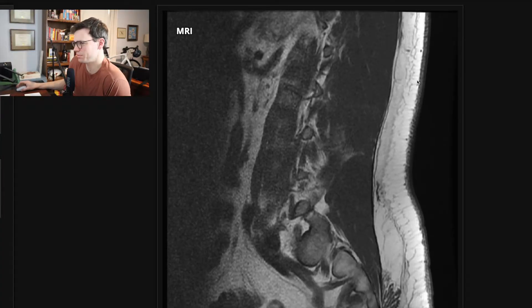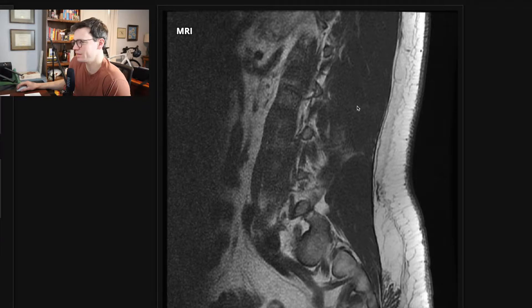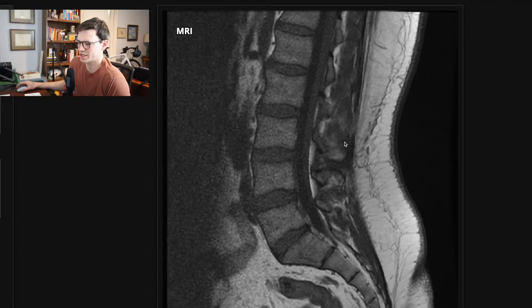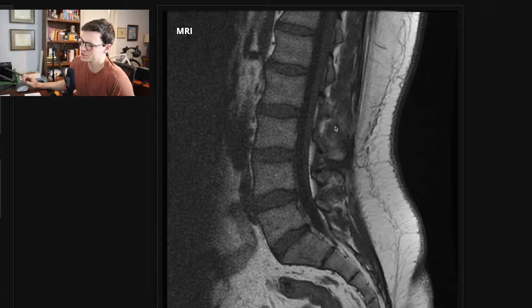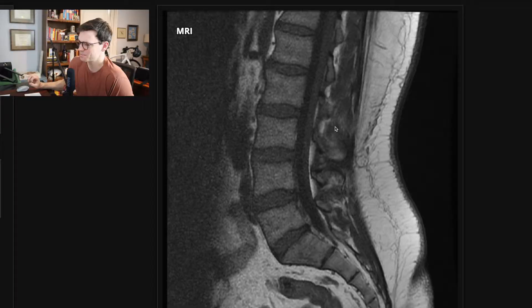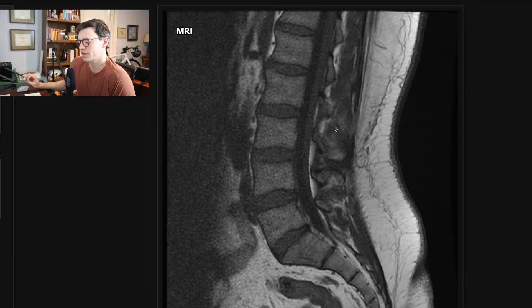If you see anything darker than the paraspinal musculature — this is the muscle here — anything darker on T1 than the muscle within the bone is pathologic, and you need to mention it. There are plenty of benign bone things as well. A lot of the benign things will be bright on T1. If you see a bone lesion that's bright on T1, classically like a hemangioma, that is a benign harmless lesion almost always, and you don't need to worry about those. It's the dark things on T1 within the bone that you have to worry about.